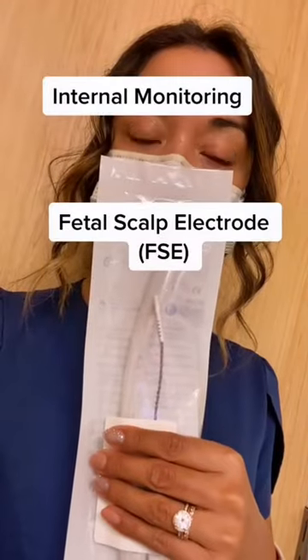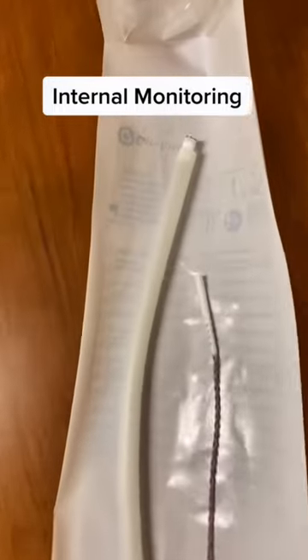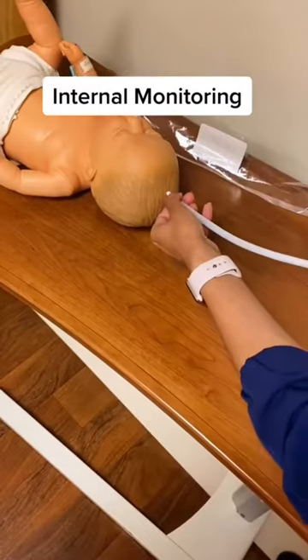This is an internal monitor — a fetal scalp electrode for more critical situations where we really need to get the accuracy of the baby's heart rate, and external fetal monitoring is difficult. This device actually screws onto the fetal scalp, and is placed by a nurse or doctor who is trained in it.